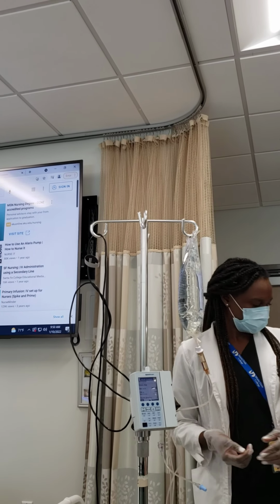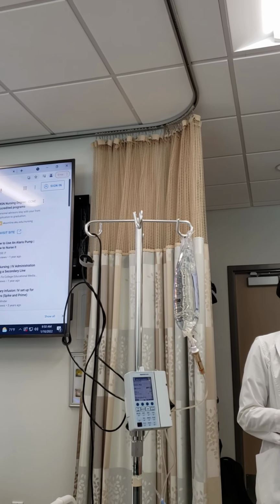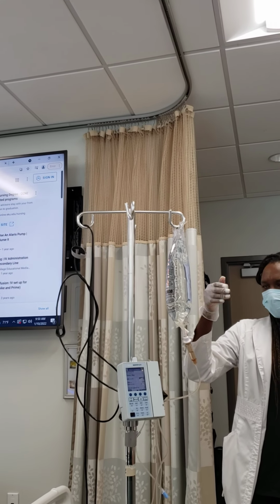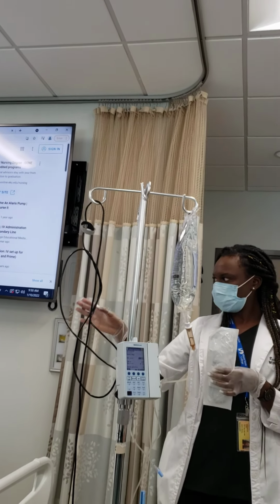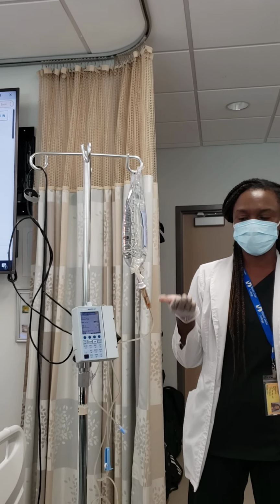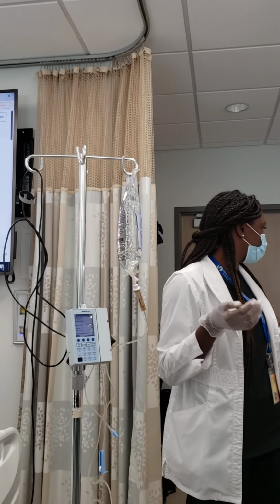Above is the medication, the rate, the date and time. You'll see this information when it comes. Most facilities will provide it to you. It's just the school that doesn't have it. If they did, I would show you how it looks.